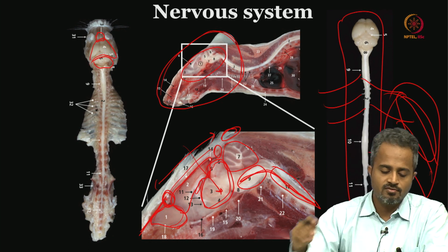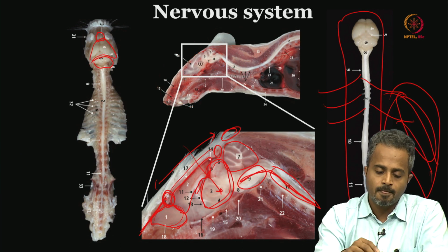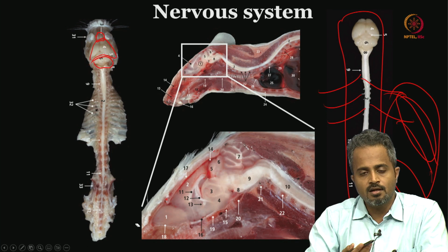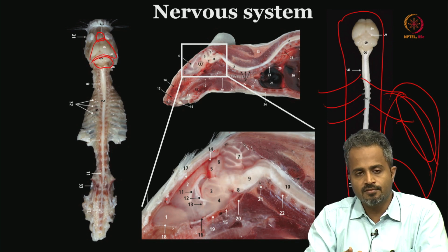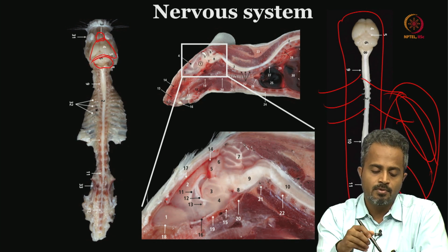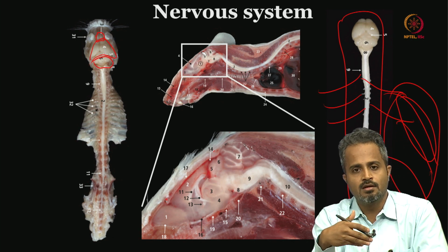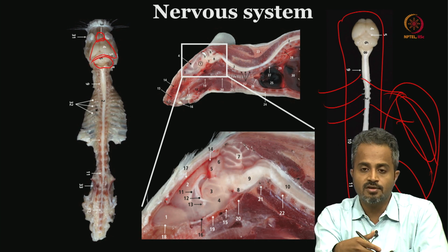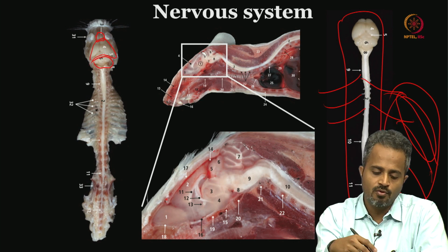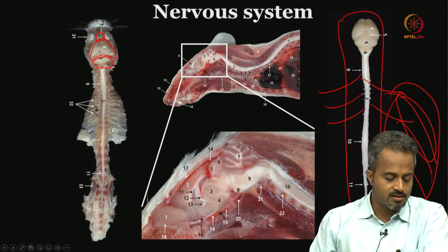This is the reason why I am trying to highlight this particular aspect, that when we extract the brain at the end of surgery, it is very vital that you maintain the structure that we have implanted. For example, you must have implanted the sensor on top. So, it is very important that you maintain it. So, the extraction also becomes very vital. For example, if we are dealing with an experiment which involves a surface electrode, I would rather harvest the brain going from below, for which I need to take off the lower jaw and go from the base of the skull there.